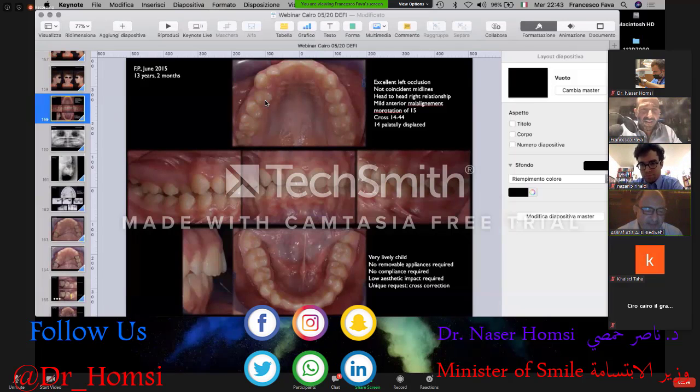Dr. Fadi Fahim asked, what is the material and wire size of the transpalatal arch and lingual arch? Thank you for the question. Yeah. There are two main options.